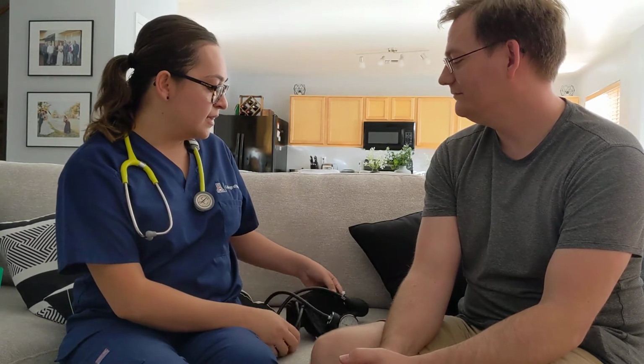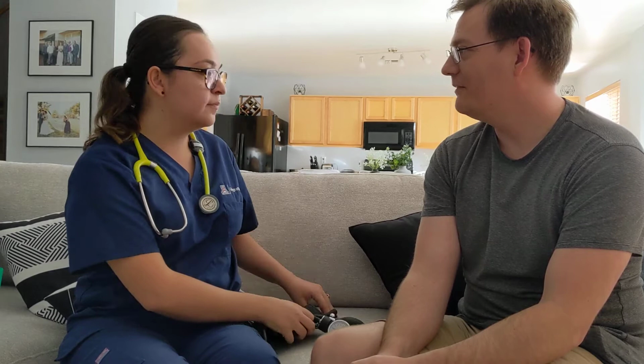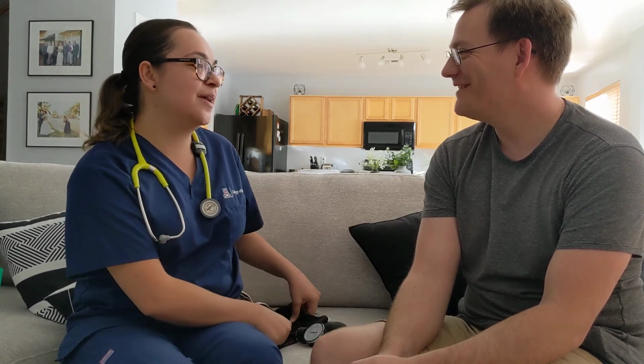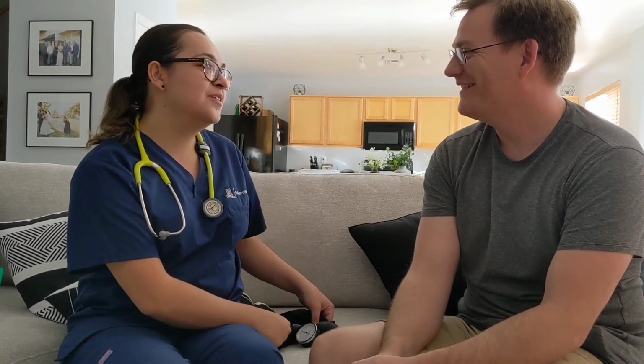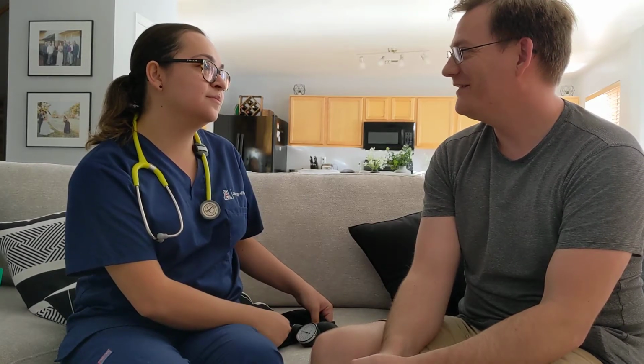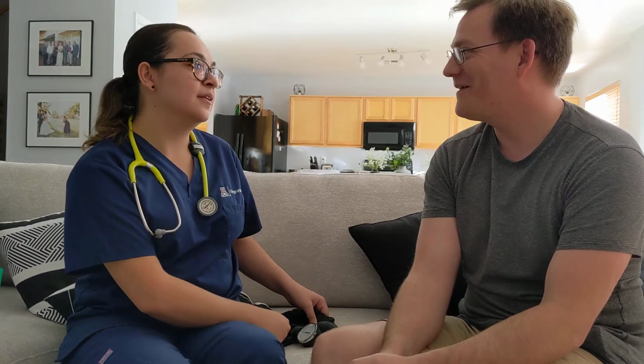So, hello, my name is Bree. I'm going to be your student nurse today. Hi, Bree. I'm gonna take a quick set of vitals if that's okay with you. Of course. Perfect. And then can you confirm your name with me? Malcolm Reynolds. Perfect. And what do you like to go by? Mal or Captain. Okay, Captain. Can you confirm your date of birth? June 8th, 1986. Okay, perfect.